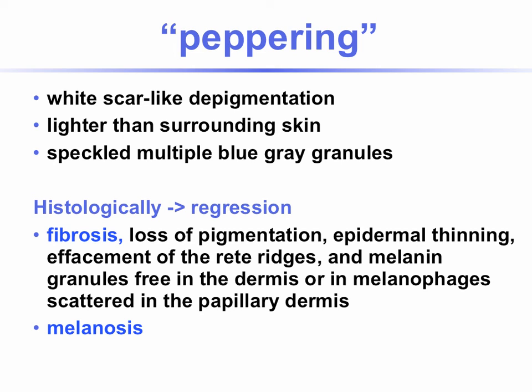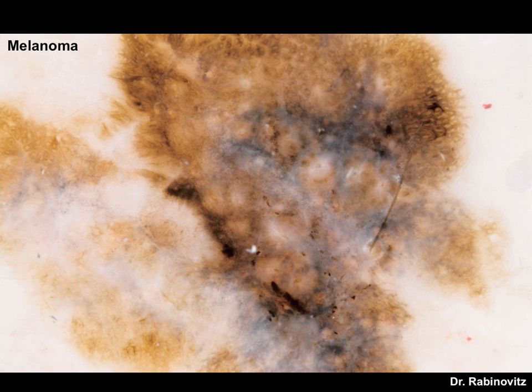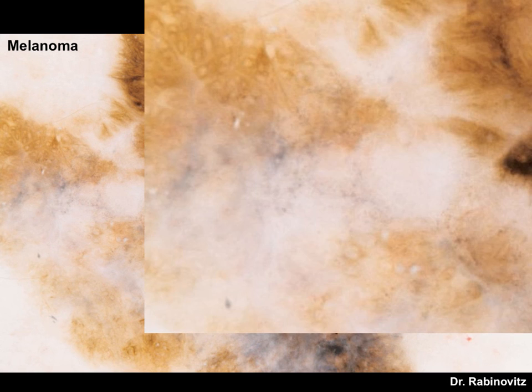Peppering is when we have a white scar-like depigmentation, lighter than the surrounding skin, speckled with multiple blue-gray granules. Histopathologically, this is seen in association with regression — meaning fibrosis and melanosis. This is a case of a regressive melanoma courtesy of Dr. Rabinovitz from South Florida. Dermoscopically, we see the peppering very irregularly distributed throughout the lesion — more than 50% of the lesion — associated with white and red color. At higher power, you see the white scar-like depigmentation with gray melanin dots at the periphery.